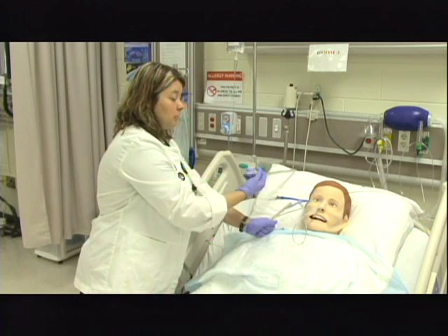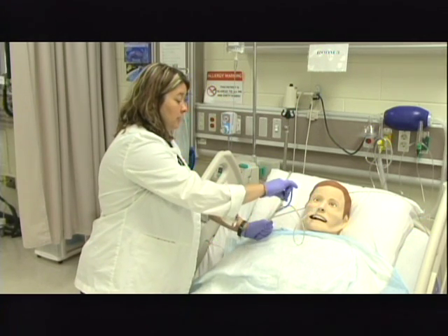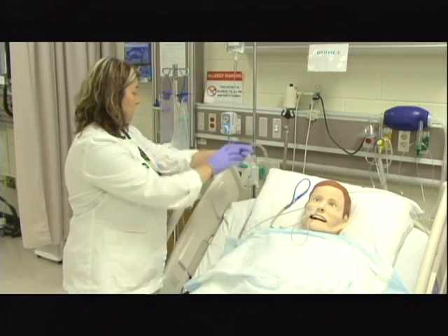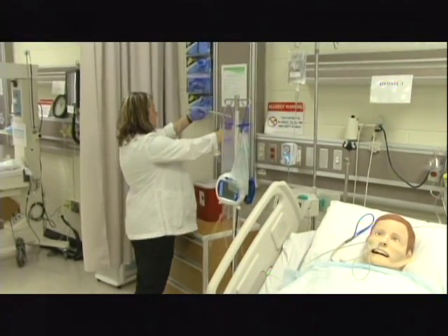I'm going to go ahead and pull the suction tubing apart and put the anti-reflux valve back into the tube. I can now unclamp, and that way I have disestablished the suction. I'm going to move this back over here out of the way.